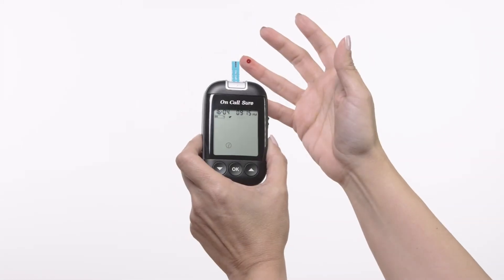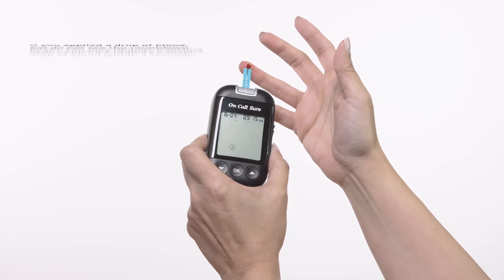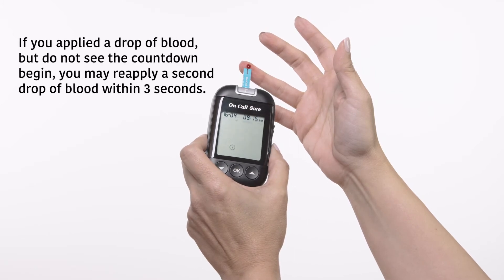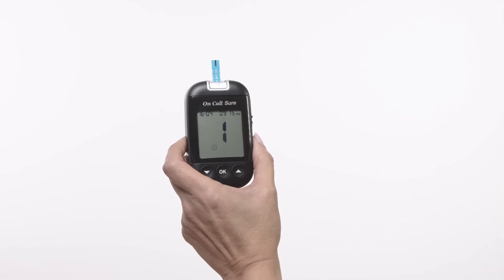Touch the blood sample to the sample tip at the end of the test strip. If the audio option is turned on, the meter will also beep to indicate the sample is sufficient and the measurement has started. The meter will count down from 5 to 1 and then display the measurement results.